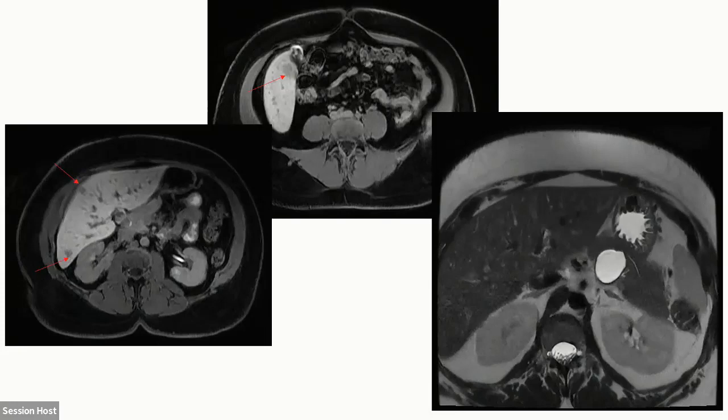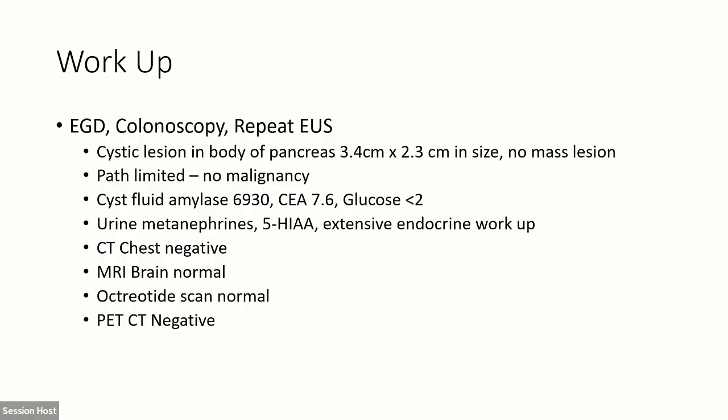Because I was worried about the pancreas lesion, though, after we discussed at length about the adrenal nodule and determined that it did not need to come out because it was not active and was also not hormone producing, we elected to proceed with doing a thorough ultrasound of the liver, a liver biopsy to prove that the lesions were not a metastatic cancer, and then to do a distal pancreatectomy and splenectomy. So that was what we did. This is all the stuff they did.